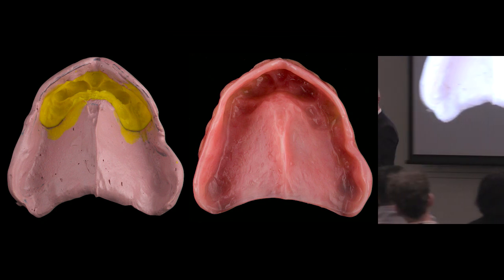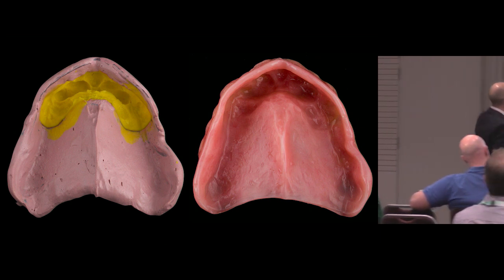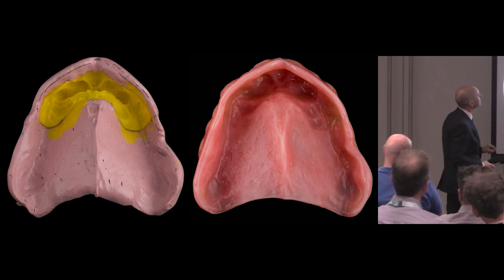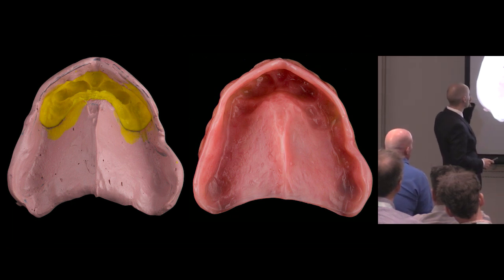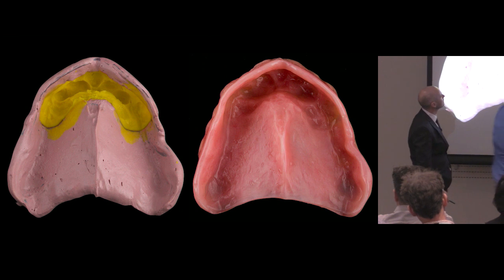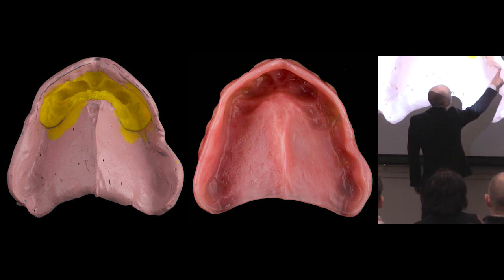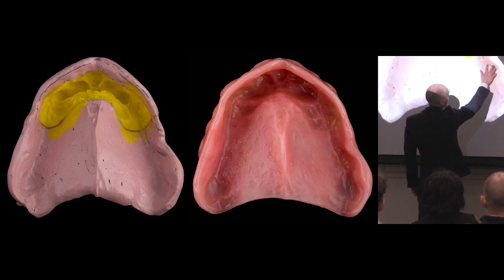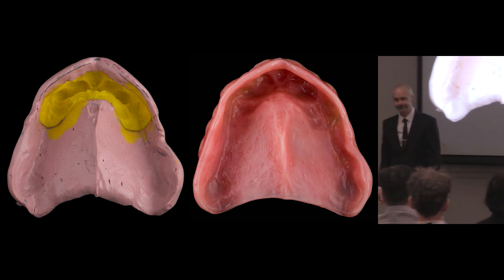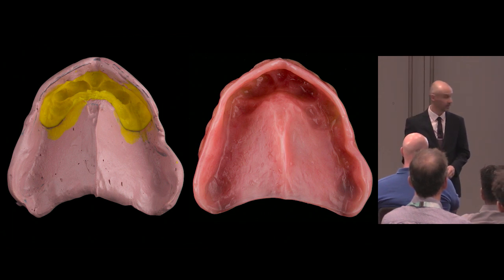In quadrant 2, just around the 2.5 buccal area, I see you put the pressure, right? Oh, sorry, I'm mixed up. 1.5. Which side is that? One? Just here. Yeah. How you've got that pressure spot there. This here? With the zinc oxide. Do you ever mark that and then relieve it on the denture, or do you just leave it as is for the finish? I'd leave it as is to finish. So I certainly wouldn't stress at all about that. Sorry, it's been so long since I've used zinc oxide.